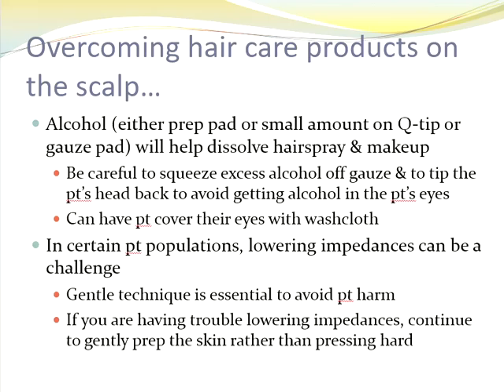The thing with alcohol is if you saturate your own gauze pad with it from a bottle, make sure that there's not a lot of excess rubbing alcohol that could drip into the patient's eyes or anything like that. Always warn the patient when you're using it so that they can close their eyes, because you forget how caustic it is, and it can burn your eyes pretty bad. Just the vapors of it being near your eyes.